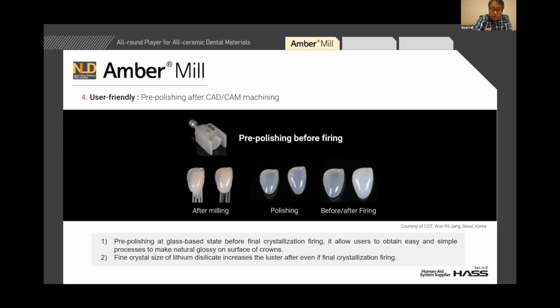So the photo on the right side: after we just finish the polishing, we can see the result after firing with the polishing only. It looks nice.